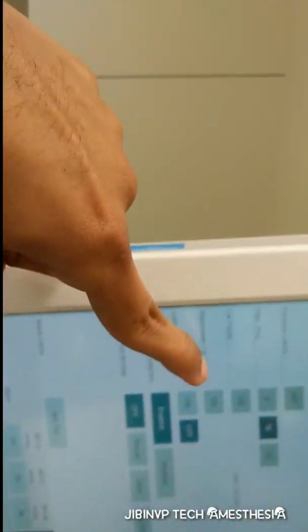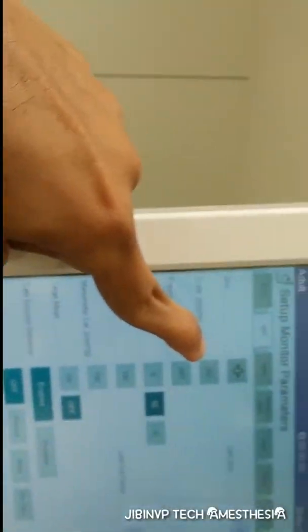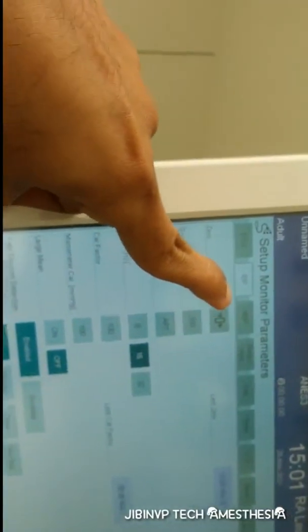Now we are in-line and our zeroing is completed. We can connect directly to the patient. If there is any disconnection for any reason, we can re-zero after patient connection. We can also adjust scaling, change the label, and set the alarm limits.